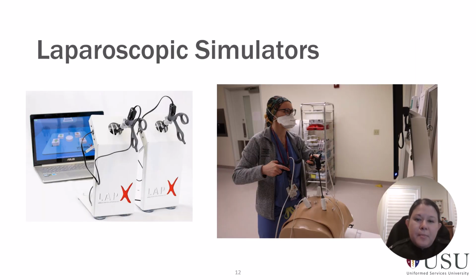And then for laparoscopic simulators, there are definitely a lot of different box trainers. I know for fundamentals of laparoscopic surgery, they have a box trainer that's available. A lot of these will hook up to a monitor so that you can get a realistic experience looking at the monitor. And then you can practice eye-hand coordination for your laparoscopic procedures.